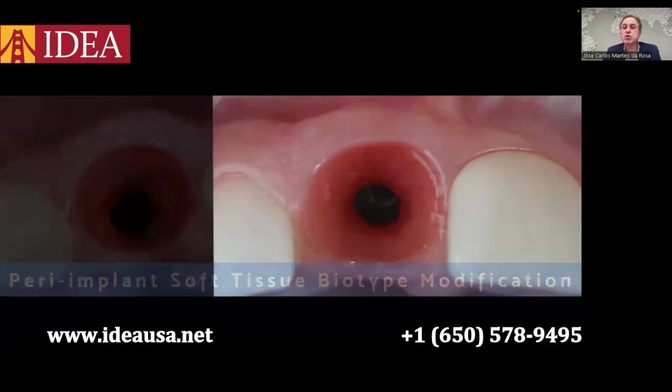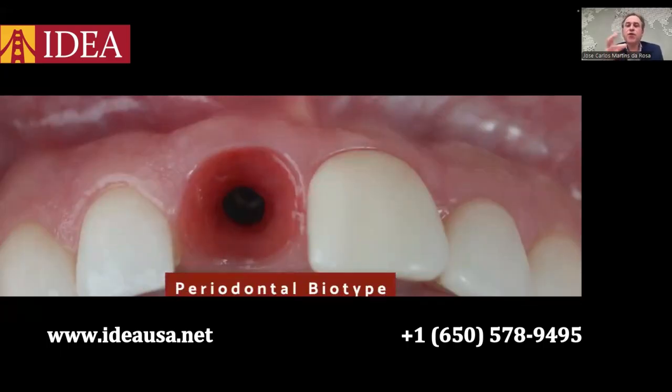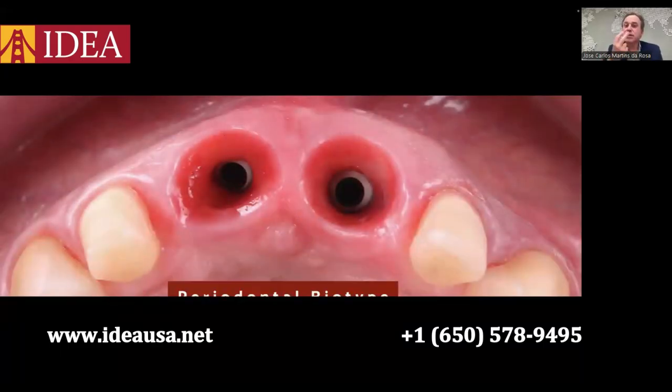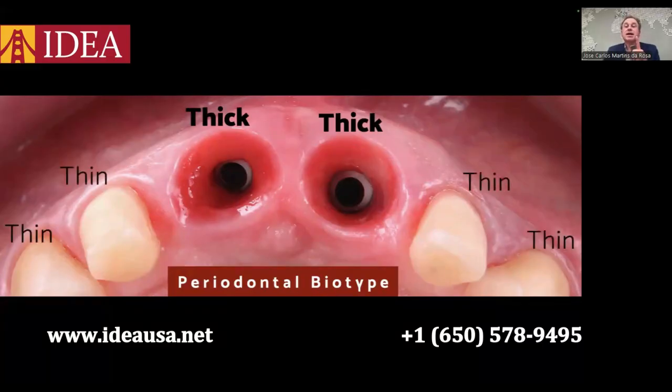If you see these two central incisors, the natural central incisor and the implant side, if you focus on the periodontal biotype, you see that in the right side we have a thick periodontal biotype, but in the left side we have a thin periodontal biotype. Let's see one more example of using IDR technique to replace two central incisors. And let's focus on the gingival thickness. We have again, in the implant side, a thick periodontal biotype in the right central incisor. In the neighboring teeth, we have a thin periodontal biotype.